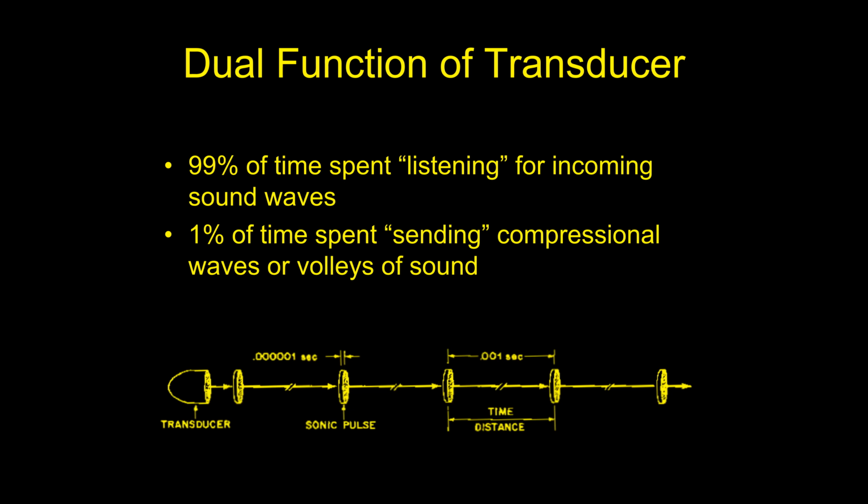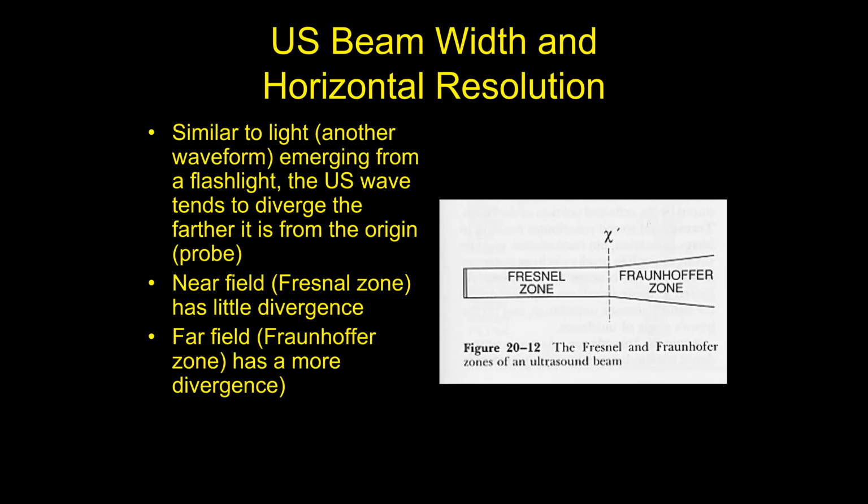Only 1% of the time when you're ultrasounding a dog is that probe actually sending volleys of sound out. The rest of the time, the great majority of the time, it is listening for incoming sound that's reflected off of things that it makes the picture of.